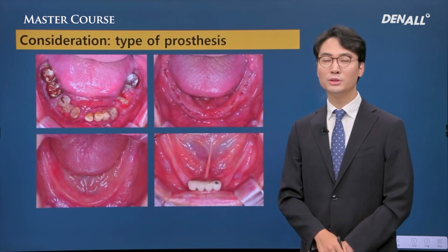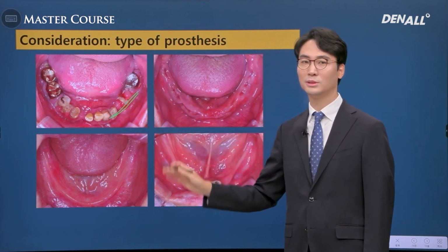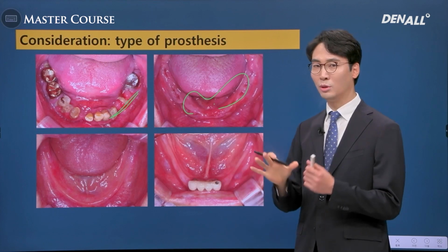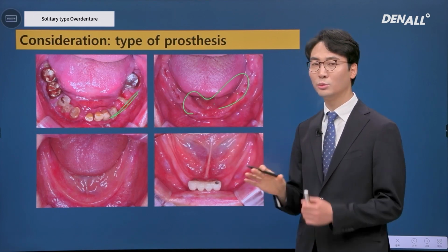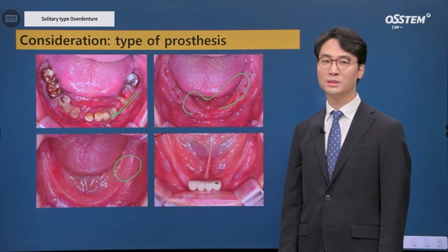On the chart, we see fully edentulous case, but in clinical situation, we come across situations where there are multiple residual teeth that require extraction. In situations where extraction has been done not so long ago, then in that case, underlying bone quantity and quality will be comparatively favorable. There can be patients who have been wearing denture for a long time as well.